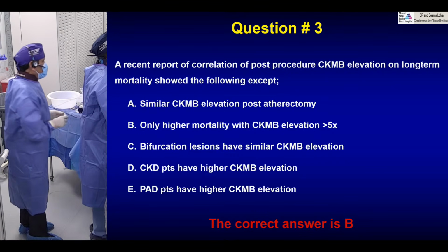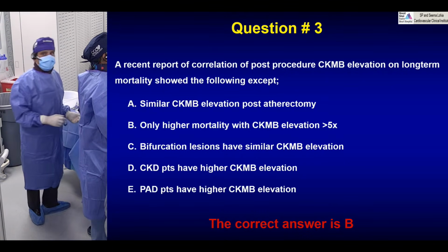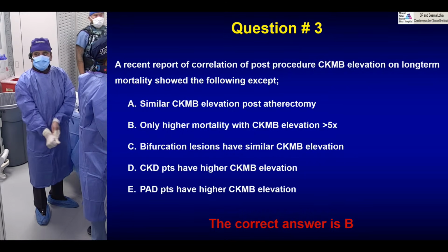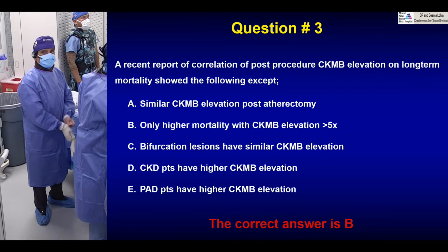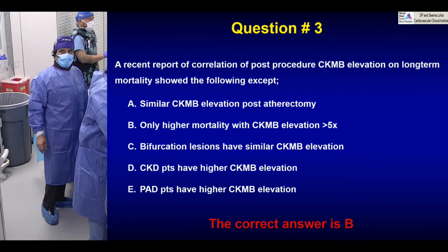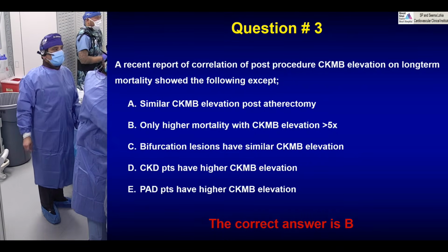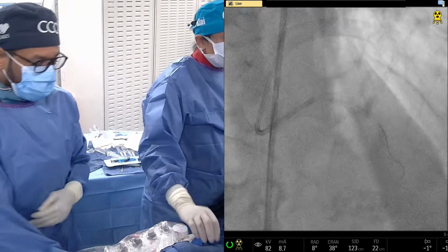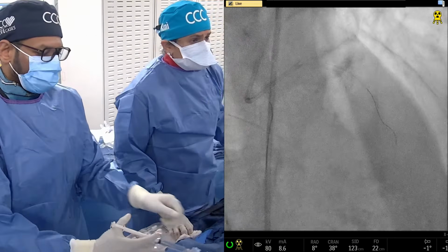And we are here now to come back to the angiogram, because Anu has finished the case and they're finishing the IVUS. Anu, with you. Yeah, now it's post. Post? Yep. Okay, show us the distal left angio now. Everything is okay? Fluoro. Yes, show the last picture and then the imaging.